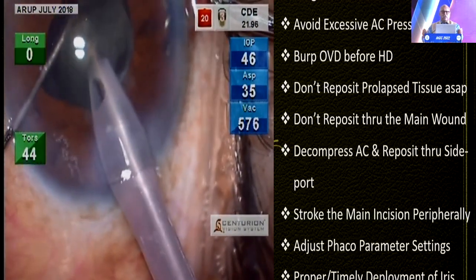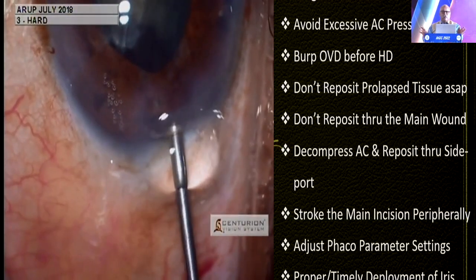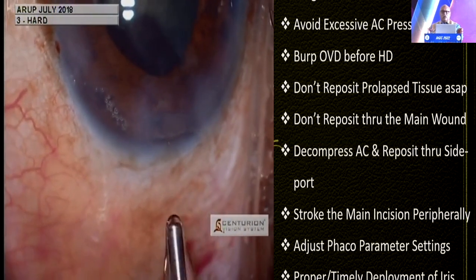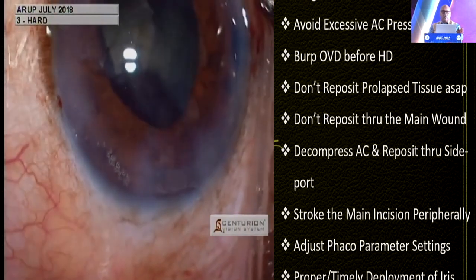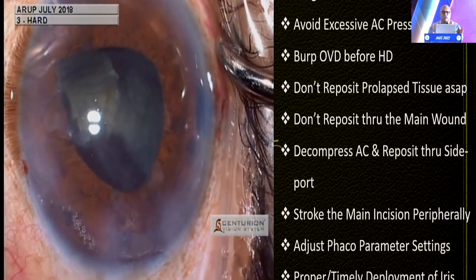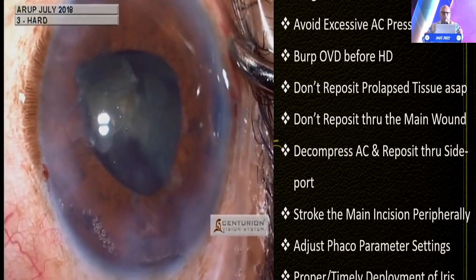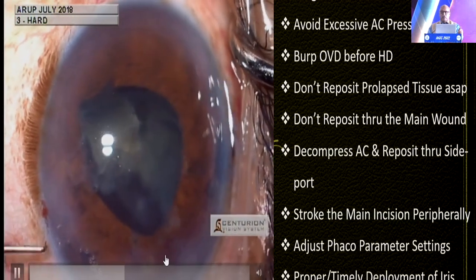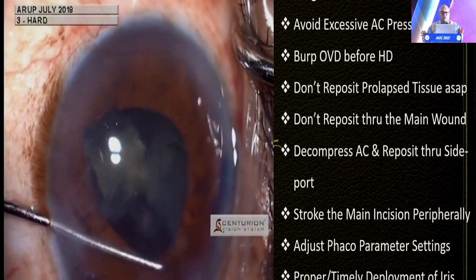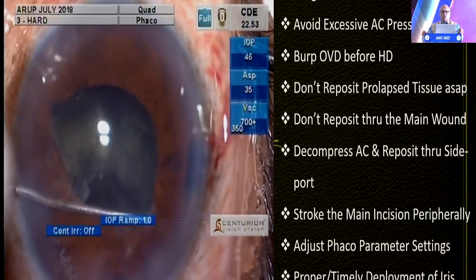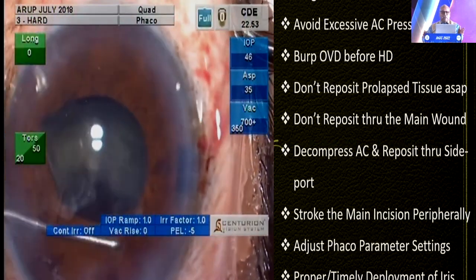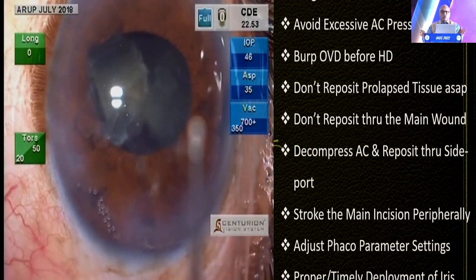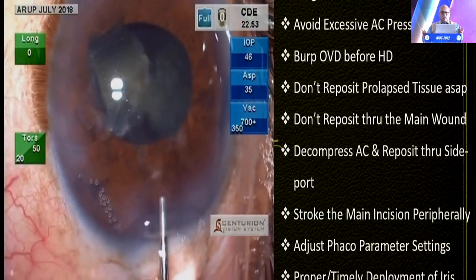It makes sense to inject a dispersive OVD in the peripheral areas where the incisions have been created. Unfortunately, the bottle got over, so I had to come out and then again injected OVD. There was a tendency for iris prolapse through the main incision in the sub-incisional area. As one of the speakers already mentioned — never, ever try to push the iris back through the main incision. Always go to the side port; use a cyclodialysis spatula or a Sinskey hook, so you don't traumatize the iris and make it more floppy.